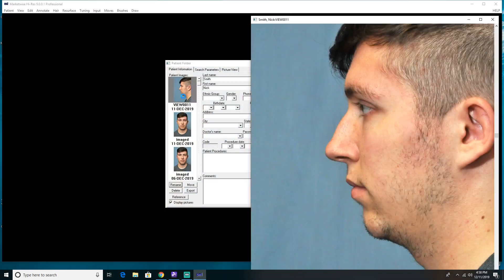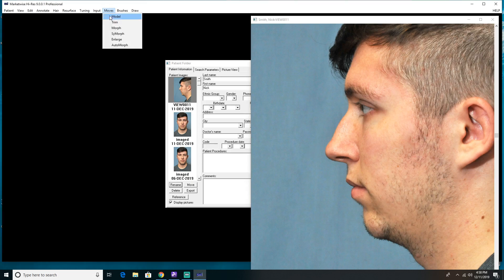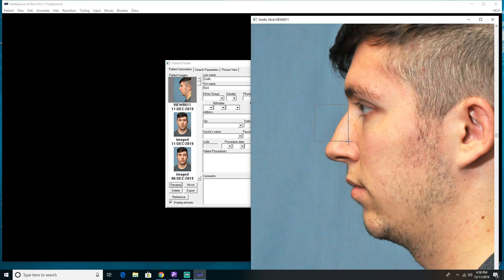Let's open up this patient's profile. We can make pretty quick work of this profile — we're going to take down his dorsal hump and do a slight deprojection. Let's go up to Moves and choose the Morph button. I'm going to very carefully make this box to include only that dorsal hump. The area in the box is the area that's going to change — I want to make sure I'm only getting that dorsal hump, not the radix, not the tip, just the hump. I'll lift my pen, put it down in the blue background area, and push down that dorsal hump diagonally. Click down and it's done.